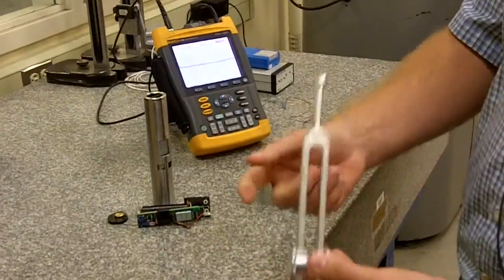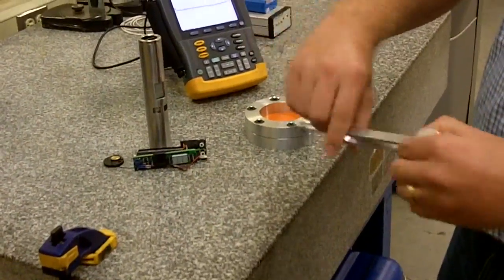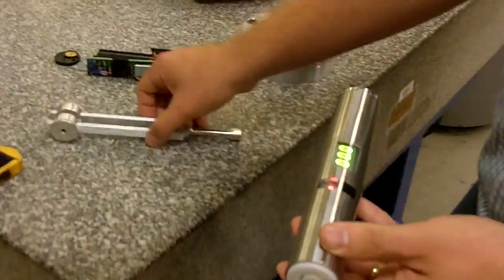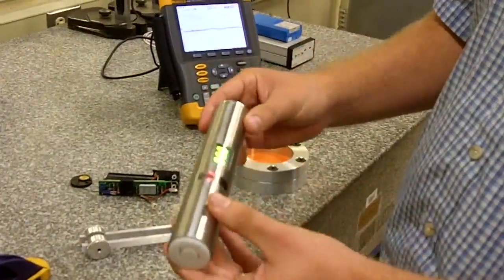We took a standard tuning fork that they would use in a test, we learned how to use it the way he would, and then we measured the vibrations at the end of the tuning fork to figure out what was going on. We've taken this device, which has a whole lot of potential for human error, and we've turned it into this electrical device, which is the same for every operator.